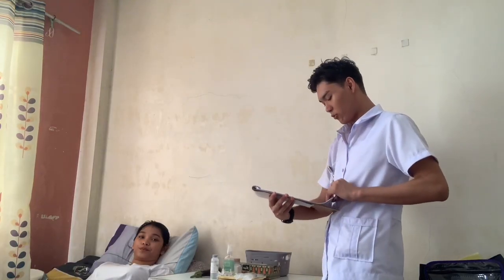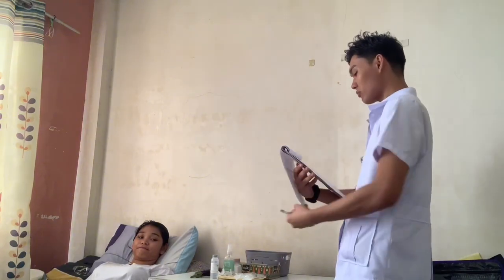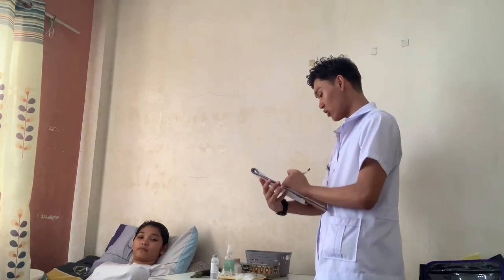Ma'am, today we'll be doing the administration of your insulin. Insulin will help your body to control your blood sugar since you have type 1 diabetes. Is that okay with you, ma'am? Before we proceed to the procedure, do you have any questions or clarification?